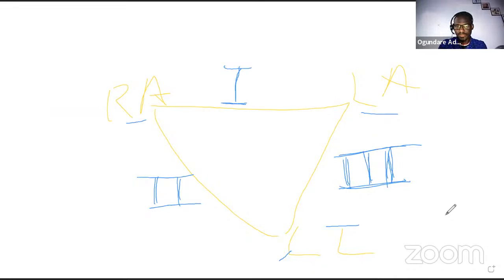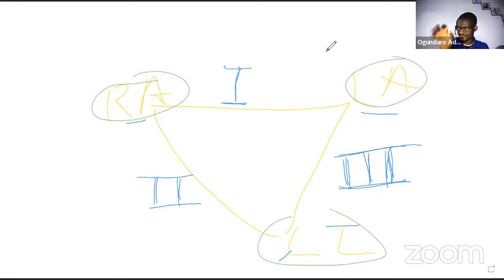So if you are conducting an ECG, remember these RA are the electrodes. The electrodes are the adhesive stickers that you put on the patients. So these are RA, you put this on the right arm, on the left arm, and on the left leg.